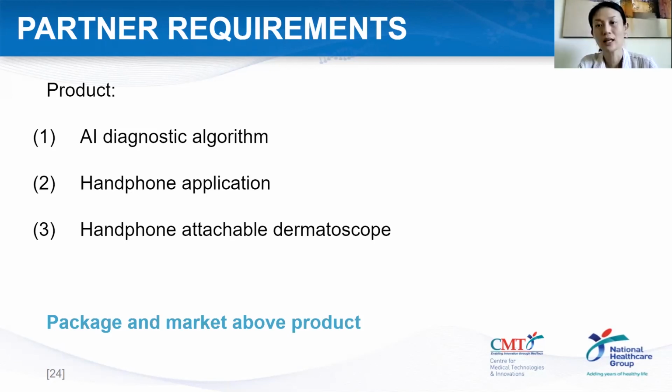Of course, NSC has its own data set of pictures. We're going to run that through for the AI to learn, because it's deep learning. The more you feed it, the more it learns. After that, we can run our trials to see how sensitive it becomes. So yes, there are publicly available data sets already. ISIC itself also has ABCDs on the website for people to look at if they're interested to learn more. They can easily go online. It's a publicly available data set, no issues at all.